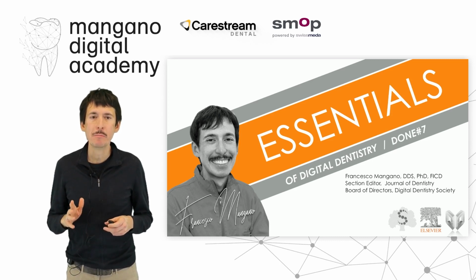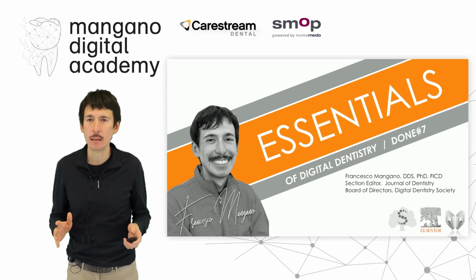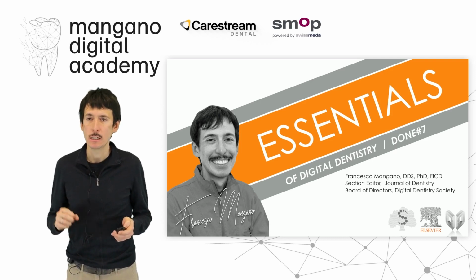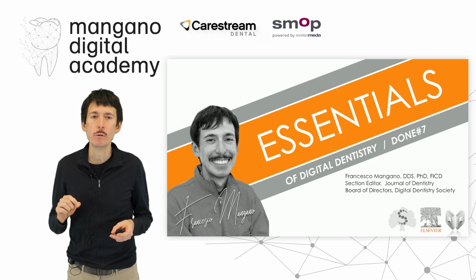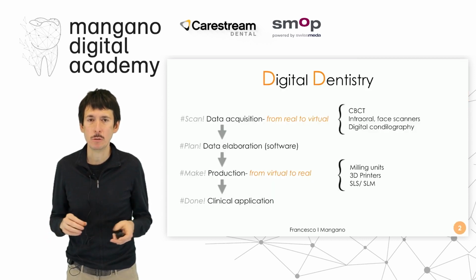In this video number 7 of the last series, the Done series, we talk about clinical application and we talk about artificial intelligence. Again, it's a very valuable and novel tool for dental practitioners and digital dentists all around the world. It is a very important, reliable tool, and it can be absolutely valuable for our workflow because it speeds up everything and allows us to work smoothly and in a better and controlled way.